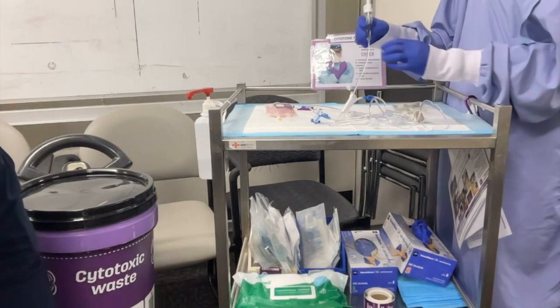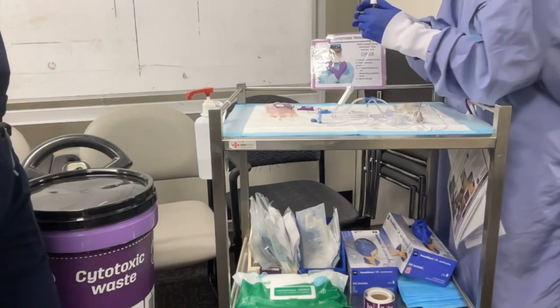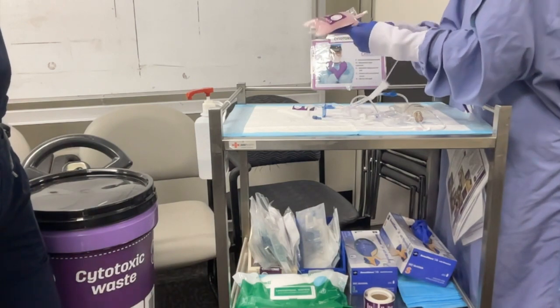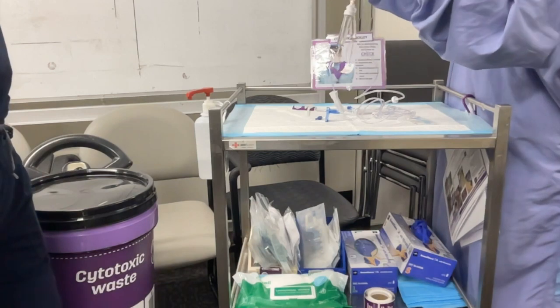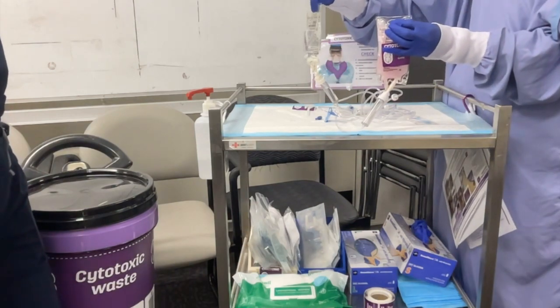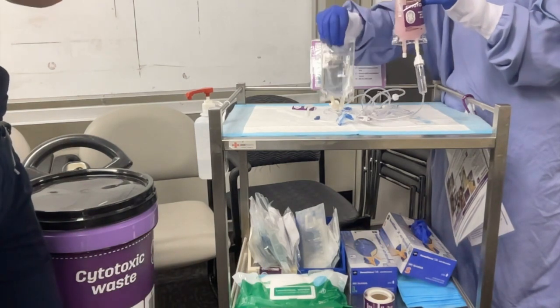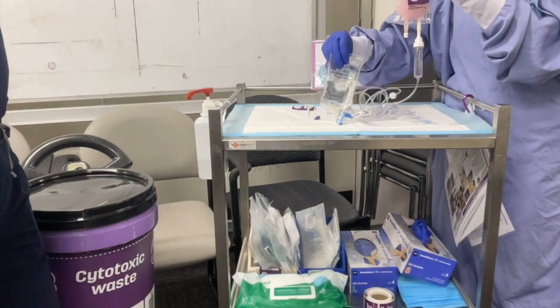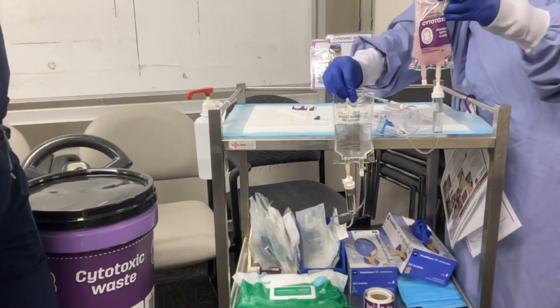What are we going to do next then? We're going to pierce the cytotoxic medication. Yeah, beautiful. So we're going to pierce this cytotoxic medication on top of the line. Which one of these do we need to hang higher on the pump? You would hang the cytotoxic medication, the drug, higher. Yeah, so the cytotoxic medication needs to be above the fluid maintenance. Do you guys know why that is?